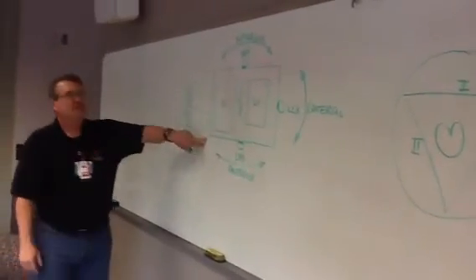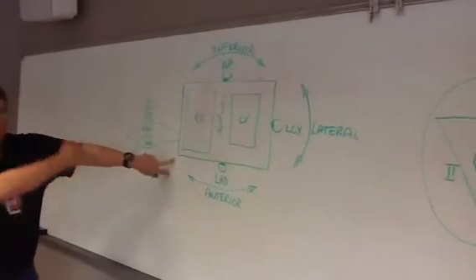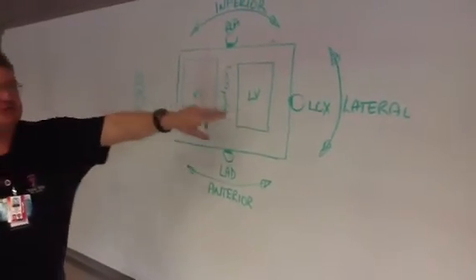All right. When you're doing your 12 leads, don't get in my face. This much. Get out of the way. Don't face the camera. Camera that way. So if you're looking down at the heart, you're looking at the right ventricle, left ventricle.